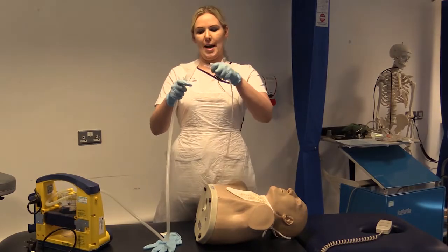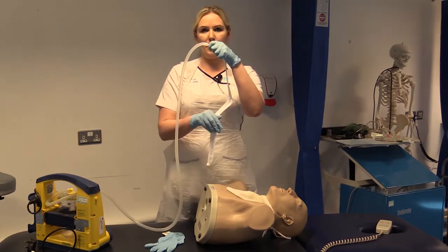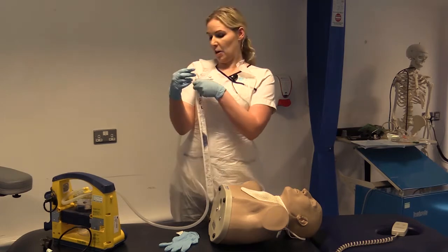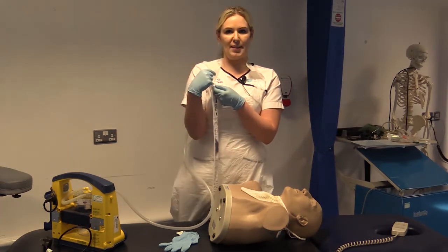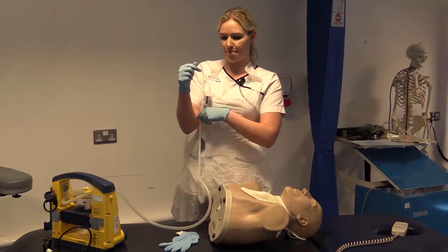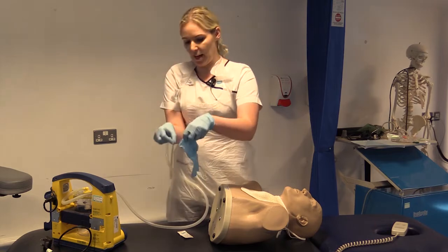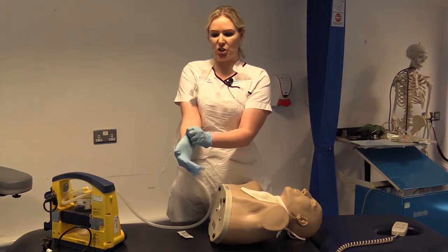And inserting your upper end into the suction tubing, keeping the rest of the catheter in the plastic sleeve to keep it as clean as possible. You're going to pop that in underneath your arm, and on the inside of the plastic sleeve there, you can add some lubricating jelly just to lubricate the tip of the catheter before you insert it. Okay, at this point then we're going to add our second glove, and this is just for your clean hand, and this is the only hand that should touch the catheter.